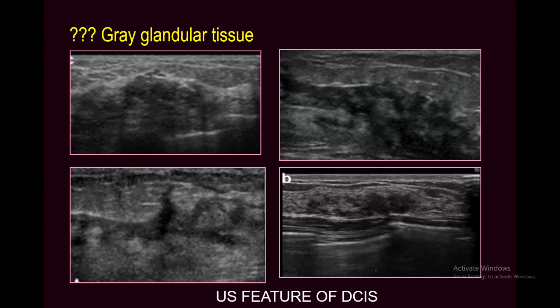Invasive lobular. Last year, at the beginning of 2003, before the war, I had one young lady presenting with an infiltrative process. The whole parenchyma was hypoechoic, distorted and hypervascular, with even skin thickening, without any single mass. It was suspicious. I recommended MRI and biopsy.